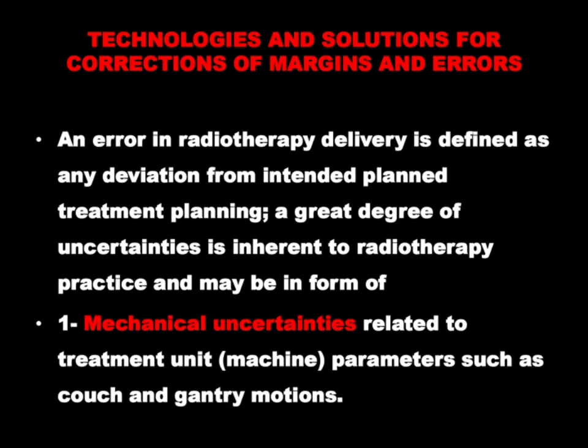Also, we go for CT-based brachytherapy in carcinoma cervix. Here, the CT compatible applicators are used, and then we take the volumetric imaging with the help of CT and MRI, and then we contour this and then deliver the radiotherapy.